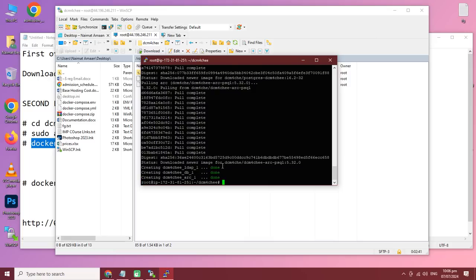It's installed. Now we need to reboot the server, and after reboot we will start the DCM4CHEE server.